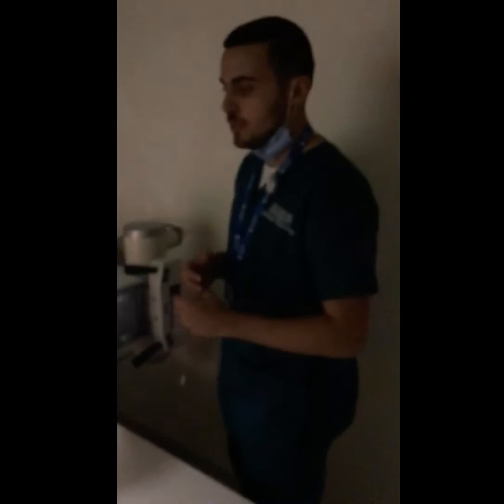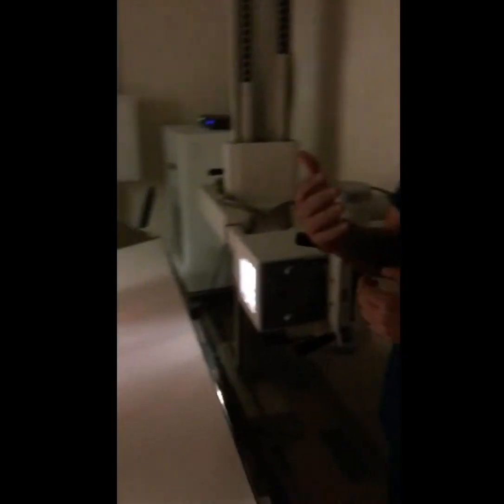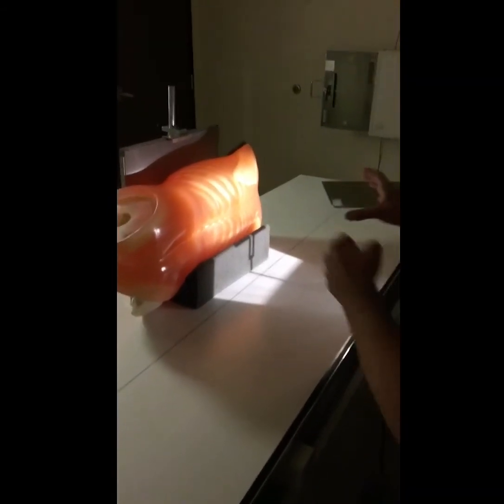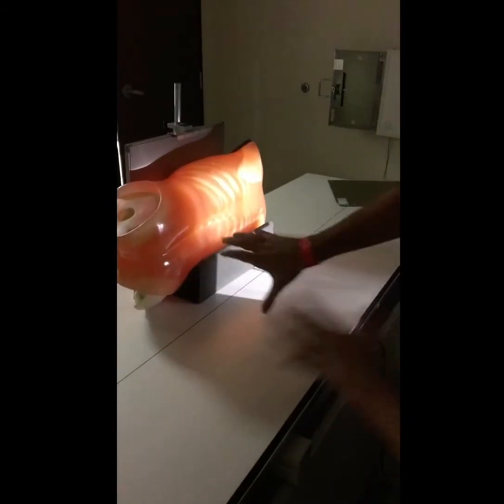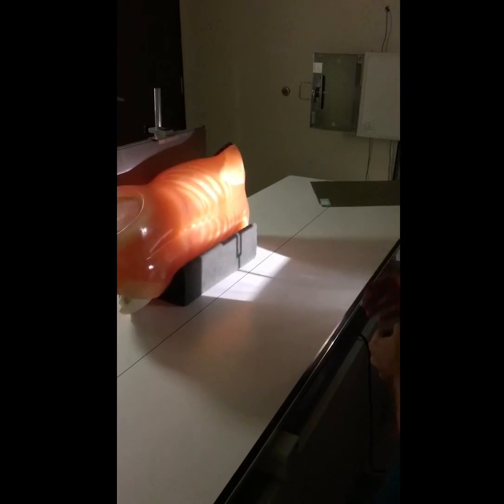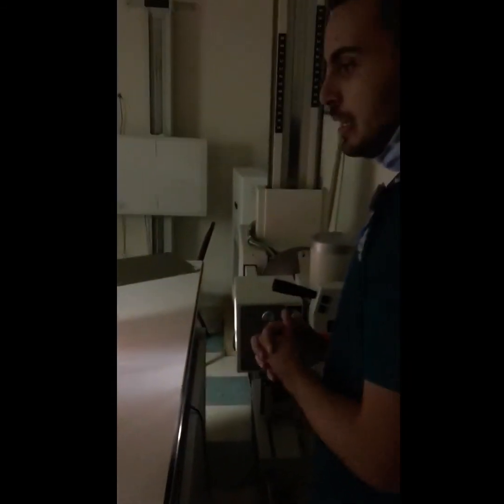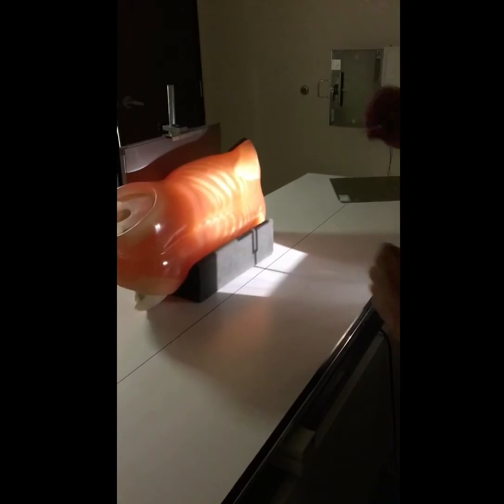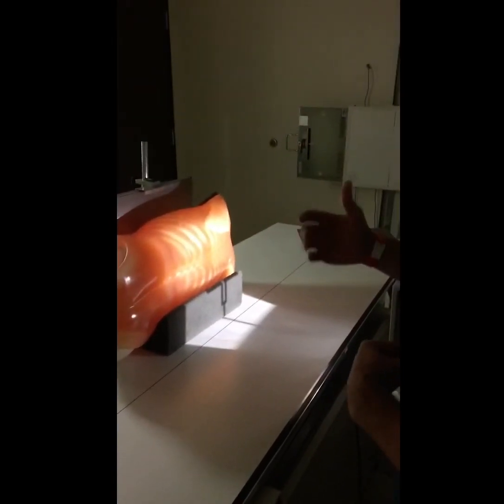Okay, so our next error is going to be an off-center error. So this happens a lot with, first of all, this is a cross table. This happens a lot with the trauma patients, like when there's problems in the lungs and all that. And it basically happens when the detector is not centered, and that's what creates an off-center error, or another name for off-center is lateral decentering.